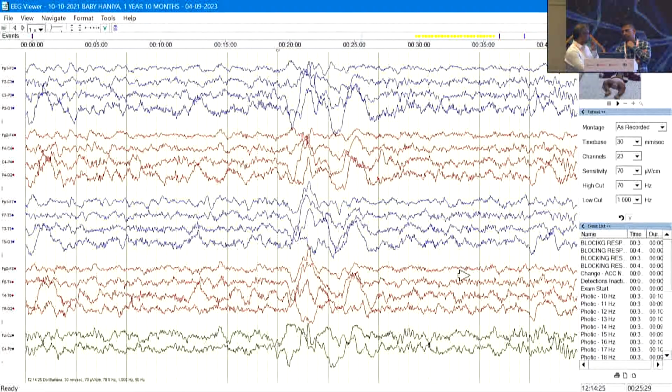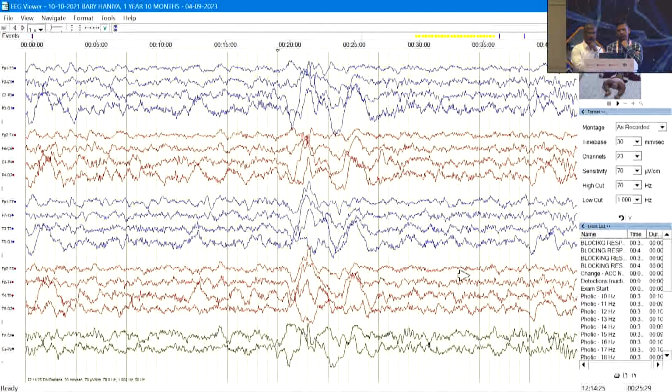Okay, up to what age? Usually below 2 years, 1 to 2 years usually. Yeah. Okay.